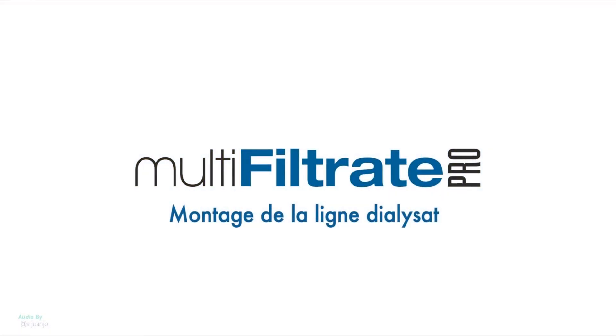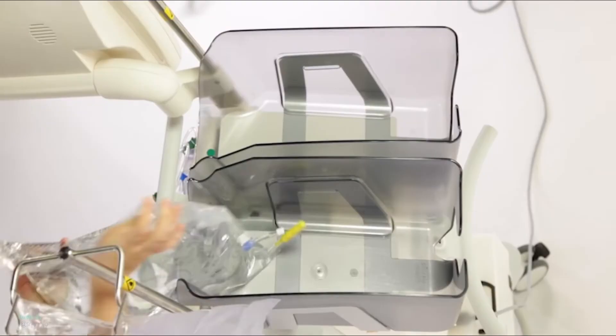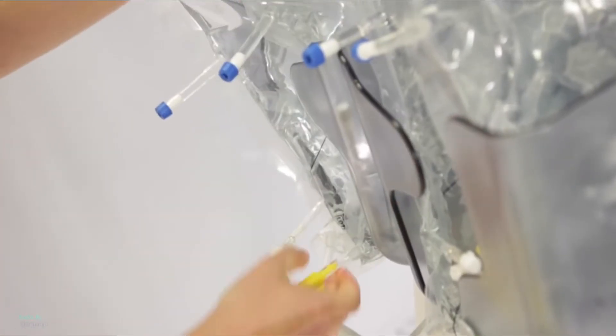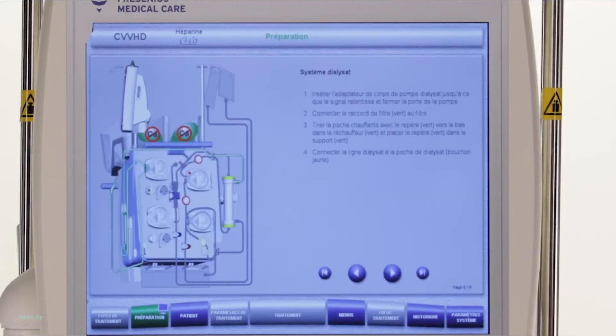Mounting the dialysate bags. Place two dialysate bags without calcium on each upper scale, scales 1 and 2. Assure yourself that they are in the right position. The bag connectors must be positioned backwards and downwards. Continue by pressing Next.